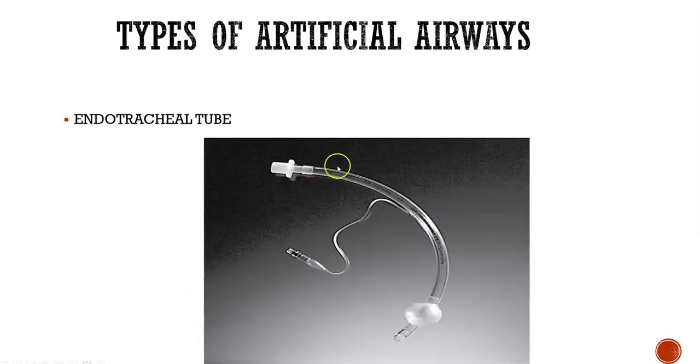When we intubate our patients, we want to mark. You see these little markings right here? So we want to make sure that we mark where our patient's ET tube is. And a lot of the times, most of the time, it's going to be at the teeth. But you'll also see it marked at the lips.